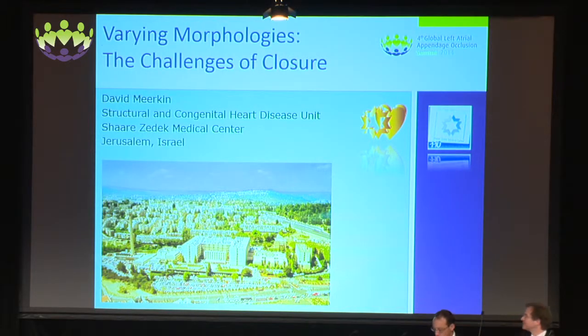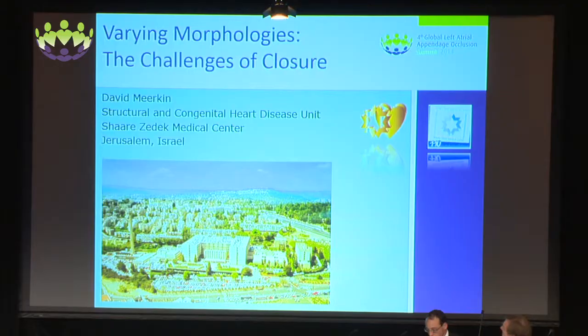I'm happy to share with you some interesting cases, but I think what I'm going to try and do is center on the topic that I was given, which was challenging morphologies. So I've changed that a little bit and called it varying morphologies, the challenges of closure.